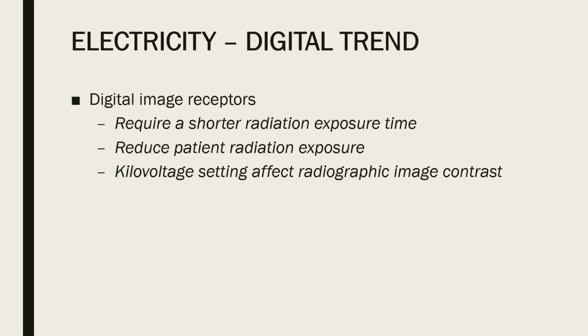Historically, dental X-ray machines have utilized alternating current, but now we have dental X-ray machines with alternating current and we have dental X-ray machines using direct current. They both produce acceptable quality radiographs with films and digital receptors.